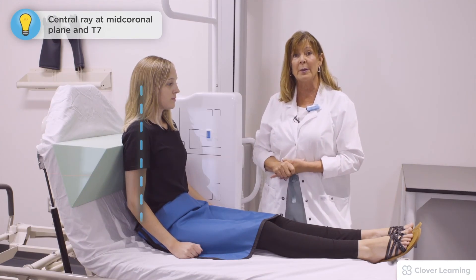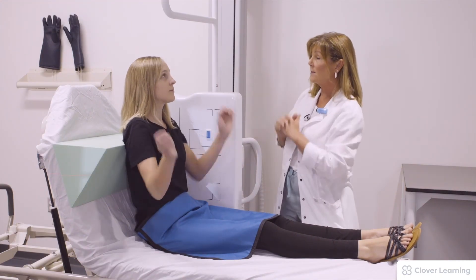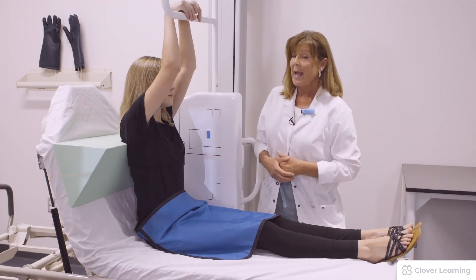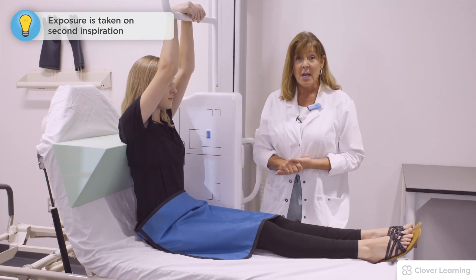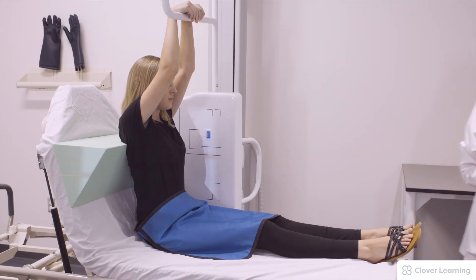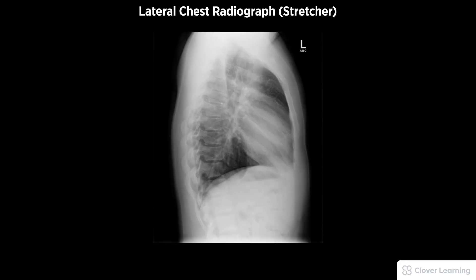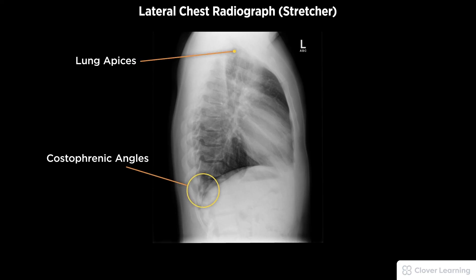I have pulled out the hand bar so the patient can put her arms up and they are not in the field of view. We are using the mid-coronal plane and T7 as our central ray. We're going to do this on second inspiration — take in a big deep breath, blow it all the way out, take in another big deep breath, hold your breath, and the exposure is made. A diagnostic lateral chest radiograph on a stretcher should be free of motion and rotation, include both lung apices and both costophrenic angles, with the hilum centered and the sternum in profile.